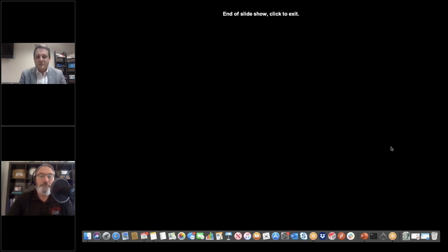We're yet to see a measure of passivation. I'm talking about an in situ measure, and something that in manufacture we wouldn't in situ measure the passive layer thickness. But you do hear that because this is a natural process, it gets thicker over time. I think perhaps what it means is it becomes more robust, you know, and as the instruments wash and oxidize more, that becomes more robust. But I'm not entirely sure about the thickness side of things, and I'd want to consult somebody around metals on that to give me a bit more info. Mm-hmm. I would agree with that too, Daniel. I think it becomes more robust, and that's what they're thinking, as opposed to it actually getting thicker on the instrument.